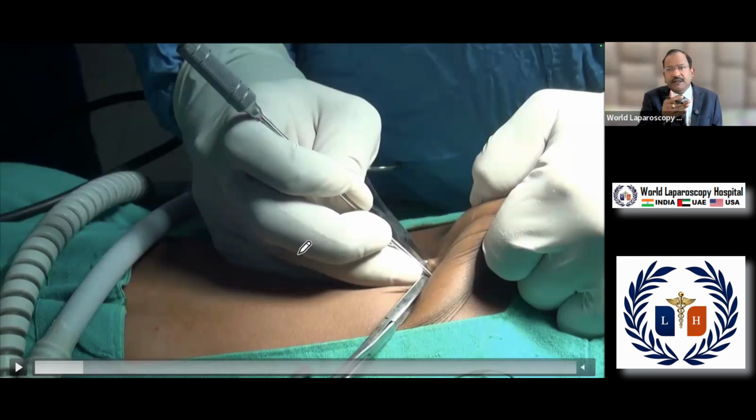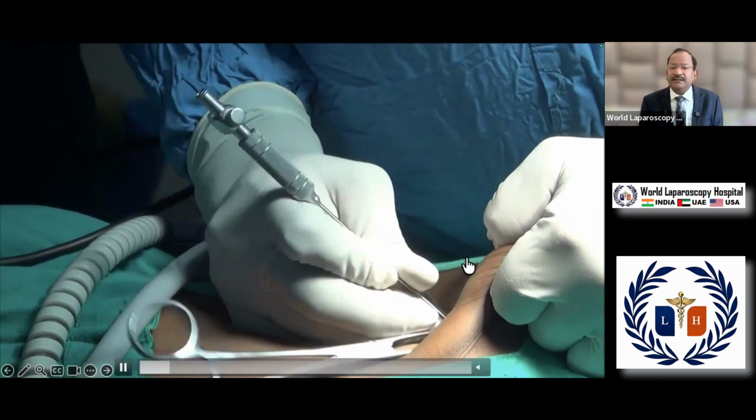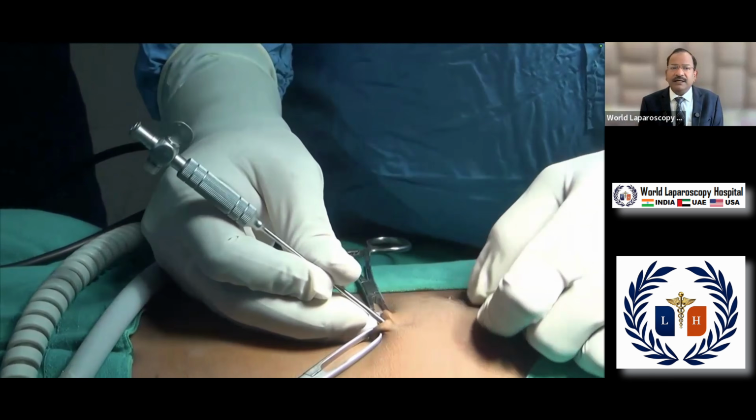The aorta is 5 centimeter above the umbilicus, bifurcating into the common iliac vessels. So there is no way it can go to the vessel, no way it can go to the bowel, and no way it will go pre-peritoneal either. Why? Because it is perpendicular to the abdominal wall, not oblique to the abdominal wall, but oblique to the body. If you cannot do this lifting yourself, ask your assistant to lift. And here this is 1 click and this is 2 clicks.